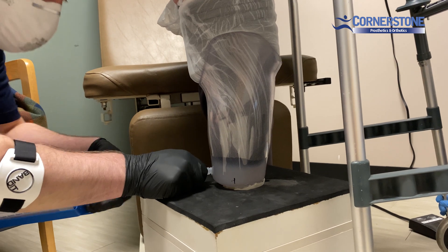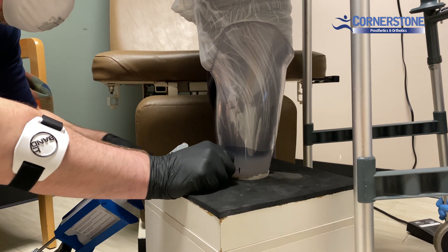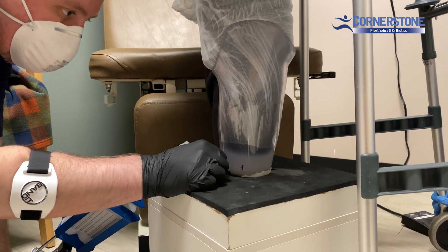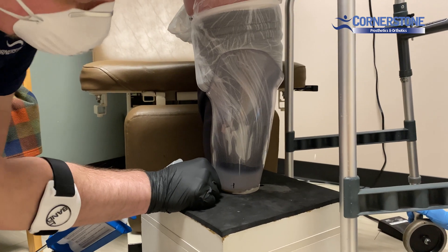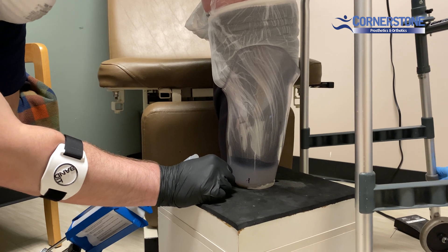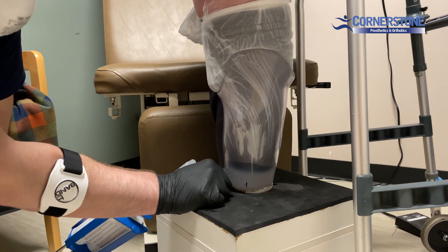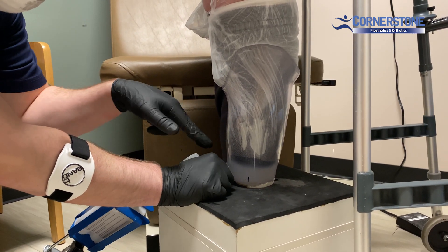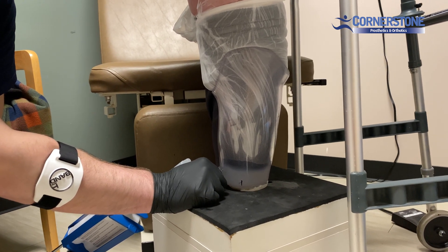So what we're going to do is let this bleed a little bit to get the air bubbles out and let the limb settle. Then we're going to plug the hole and just hold until it cures — it takes about six to seven minutes to cure. Once it's cured, we'll take the silicone pad out, trim off the really thin area, and we'll have our custom molded injected silicone pad.